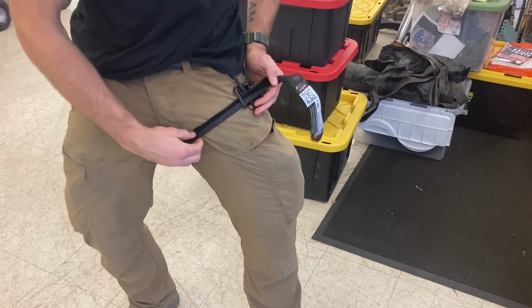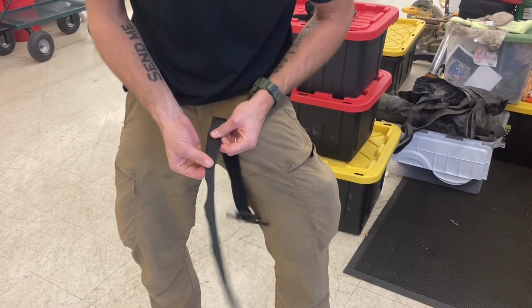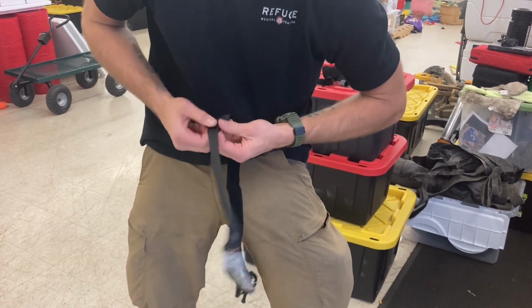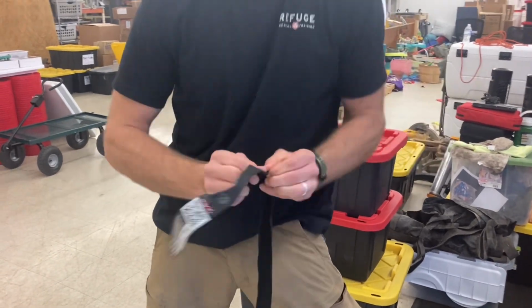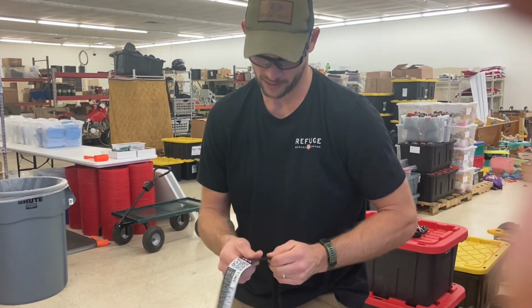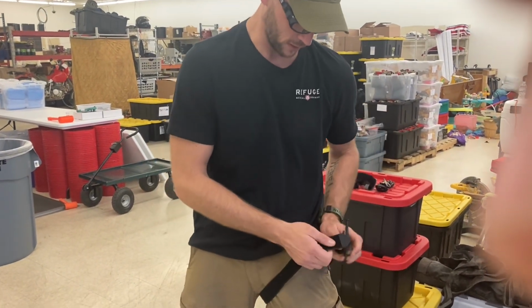See, because it's catching on itself, it's causing this strip to get too narrow. Let's see if I can straighten it. And this is not the only tourniquet that this happened on. Come on. I never have to do this with a CAT, ever. Occasionally you have to run your fingers down it to straighten it out and get it to separate, but not like this. This takes way too much effort to practice with. If it takes this much effort to practice, nobody's going to do it.